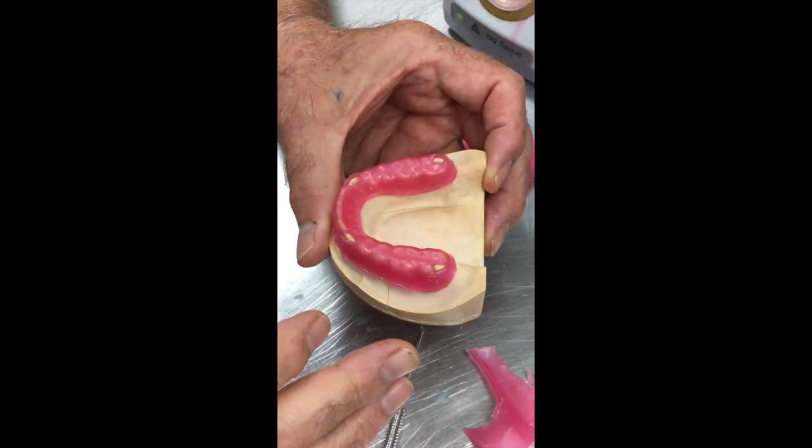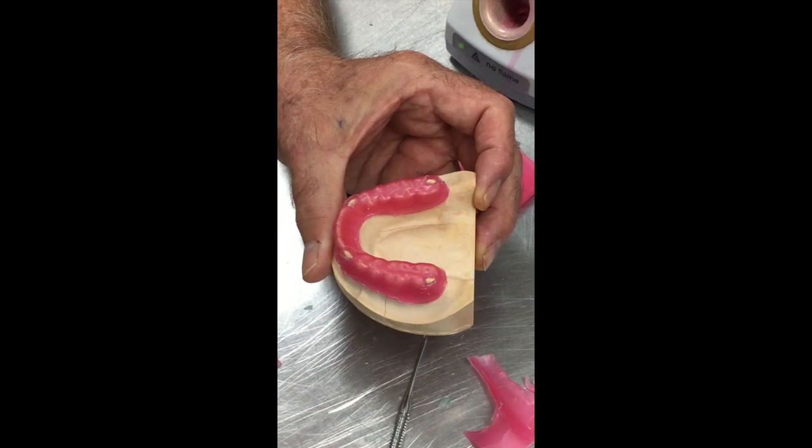So we're ready now to adapt our tray material and handle. The choice of tray material is really up to the person making the tray, but I'm suggesting that acrylic trays, which involve mixing monomer and polymer together and then adapting it, are more difficult for practitioners who are making occasional trays. So I'm going to suggest that the most economic way for someone to make a tray in a surgery situation, where there are occasional trays made, would be to go with a light cure resin. Slightly more expensive, but a lot easier to manage and not as technique sensitive.